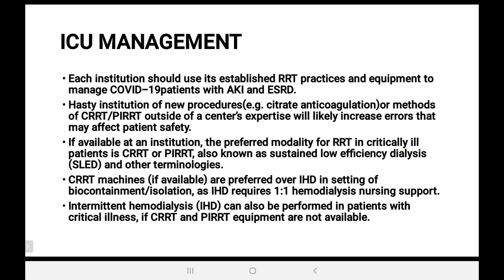Each institution should use its established renal replacement therapy practices and equipment to manage COVID-19 patients with acute kidney injury and end-stage renal disease. Hasty institution of new procedures like citrate anticoagulation or methods of CRRT or PIRRT outside of a center's expertise will likely increase errors that may affect patients' safety.